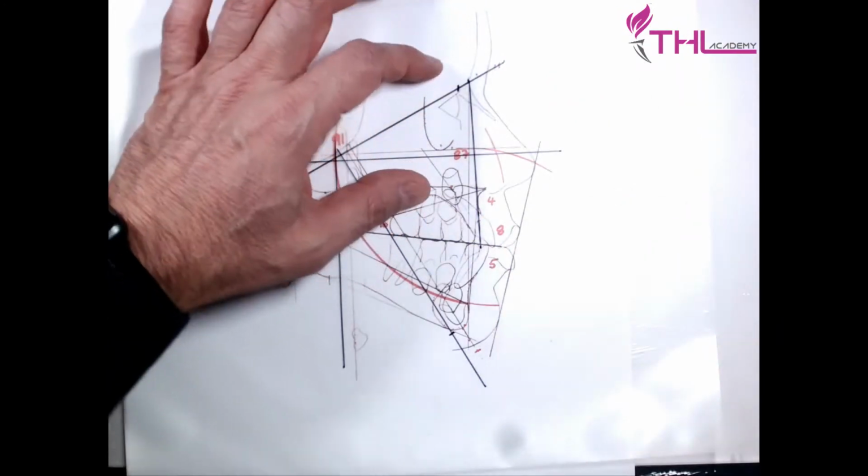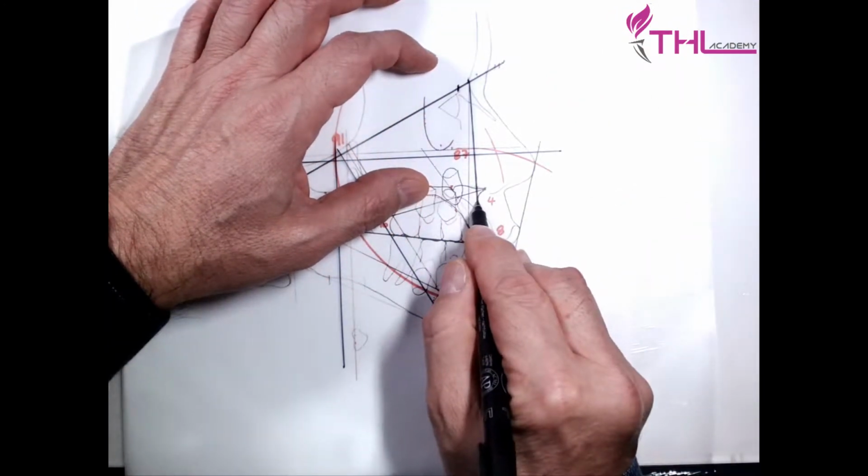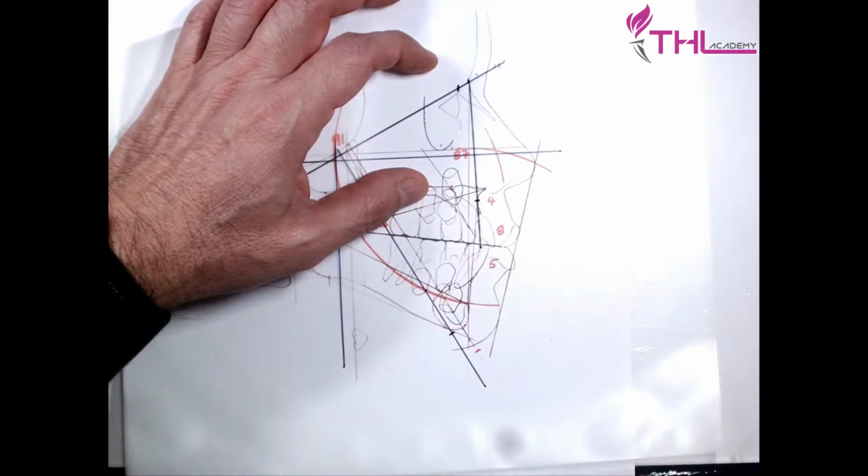I draw again the nasal plane, a very nice point in point A.